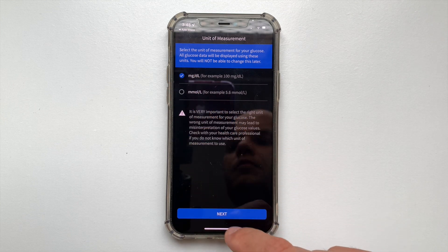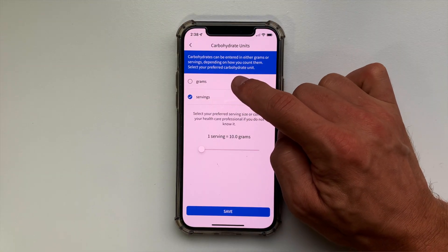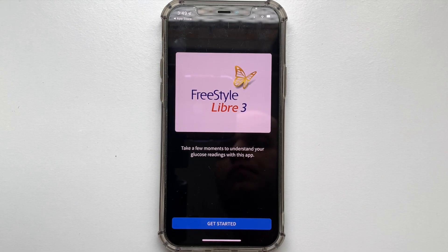Next, you can choose units of measurement for your blood sugar levels, and you won't be able to change this later, so please select the one that you are really used to — otherwise you will have to do a lot of maths in your head later. You can also choose how the app will measure carbohydrates, either in grams or in servings, and this one you will be able to change later.